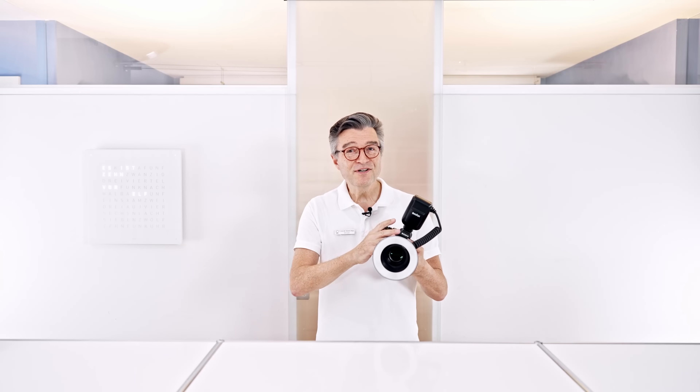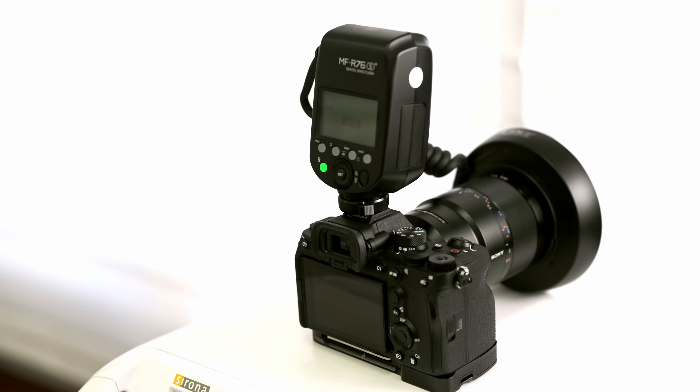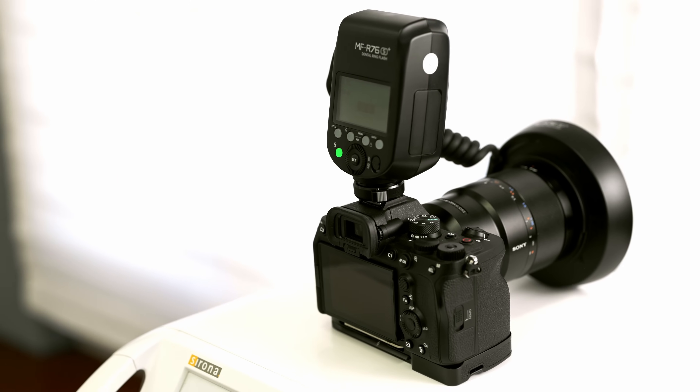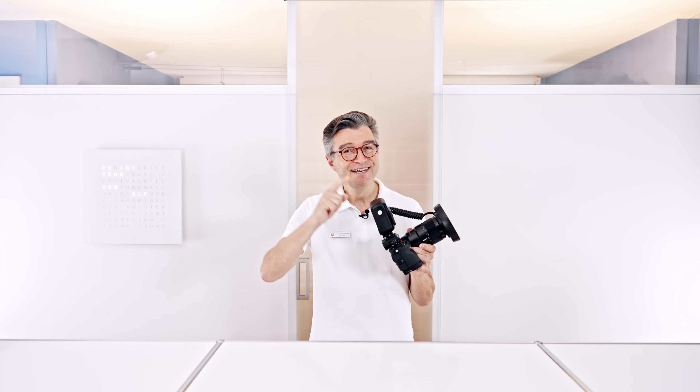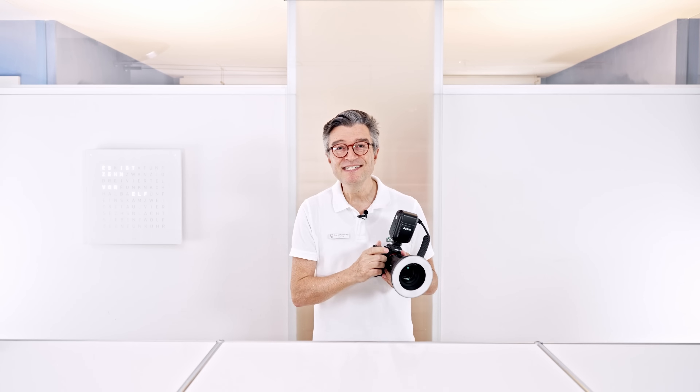Overall, the Sony Godox combination helps you to improve your image quality every time, and it's easy to use. Additionally, you also have a built-in TTL function, making shooting images even easier.